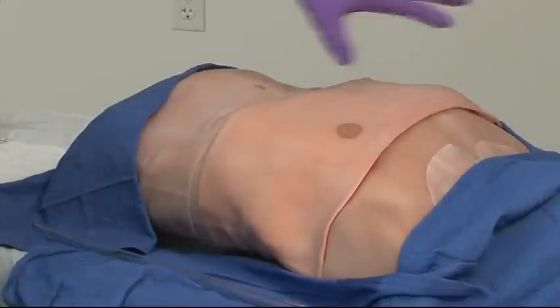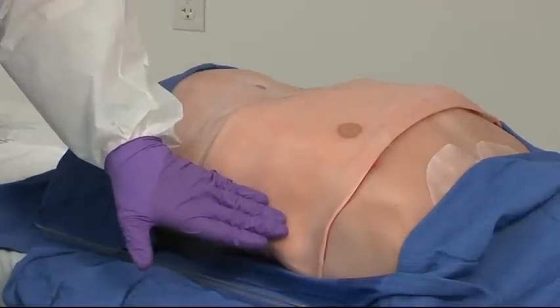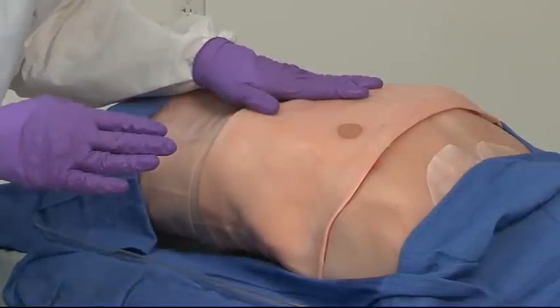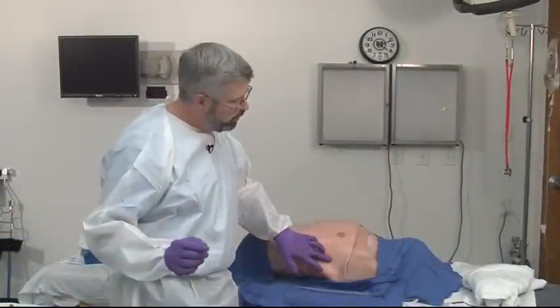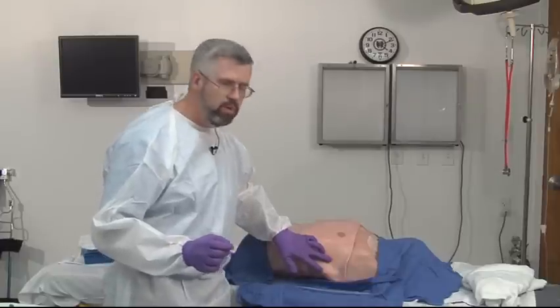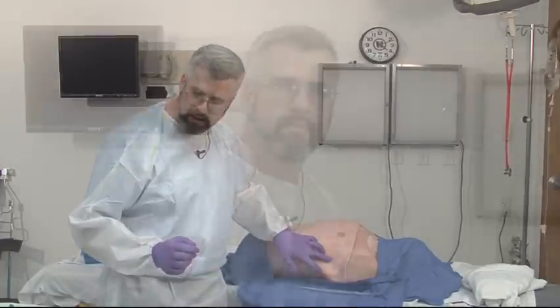Obviously, you want to make sure that you prep this area widely. You're going to once again reaffirm your anatomical landmarks, which are going to be the 4th or 5th intercostal space, approximately right here. If this patient is somewhat aware, it's good to put in some local anesthesia, but we'll assume that this patient is comatose and doesn't need it at this time.